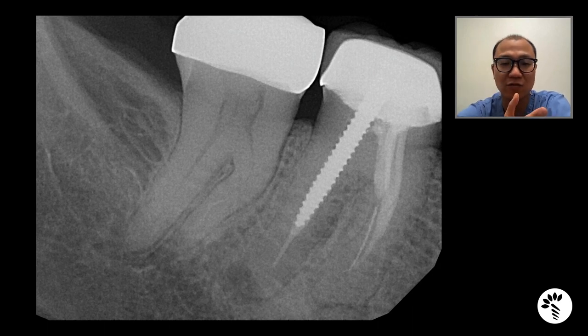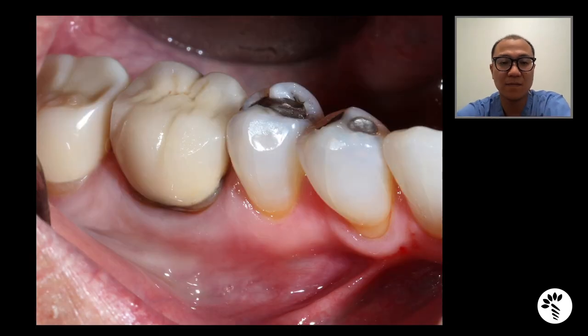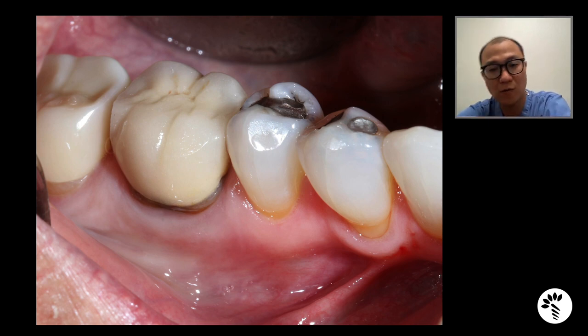Thus, we decided to extract number 30 and plan for socket grafting and implant placement in the future. On the buccal aspect, you can actually see there is some recession, most likely suggesting that there is some buccal dehiscence on the crestal aspect. And to preserve the volume of the bone, we decided to perform socket grafting at the time of extraction.